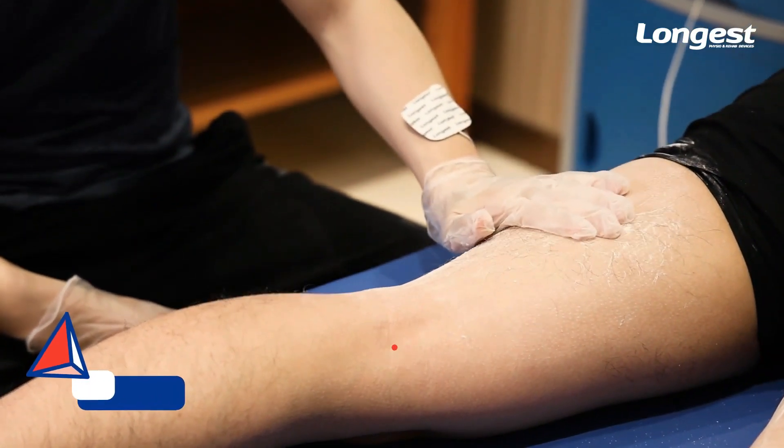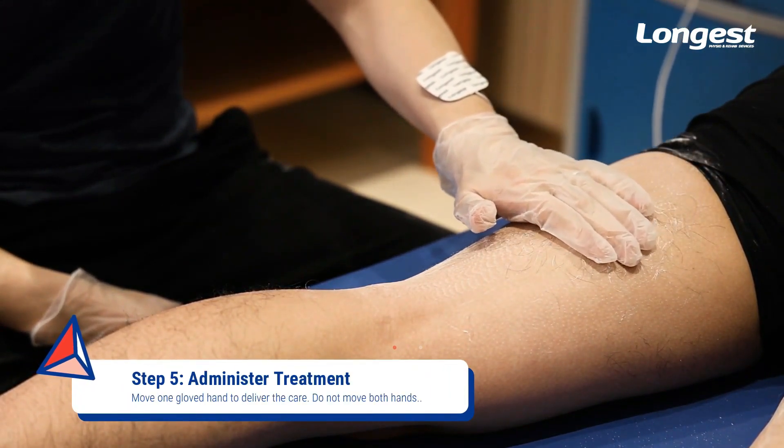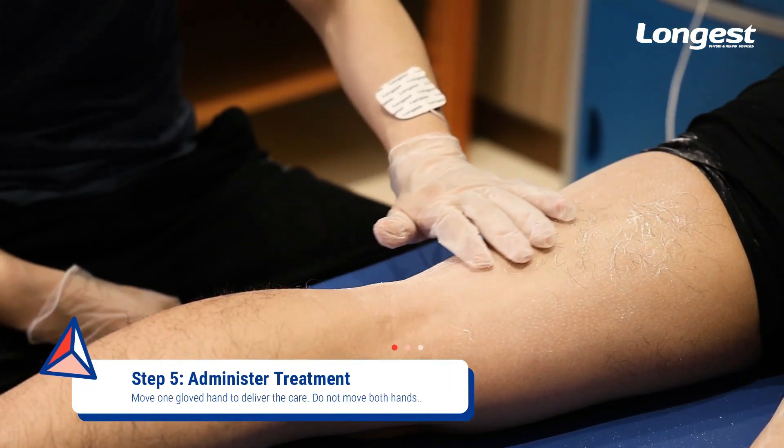To administer the treatment, move one of your gloved hands to deliver the care. Please note: do not move both hands.